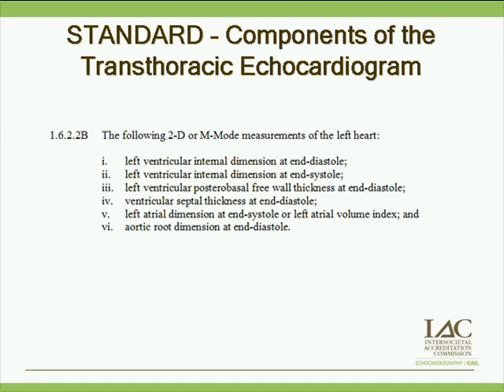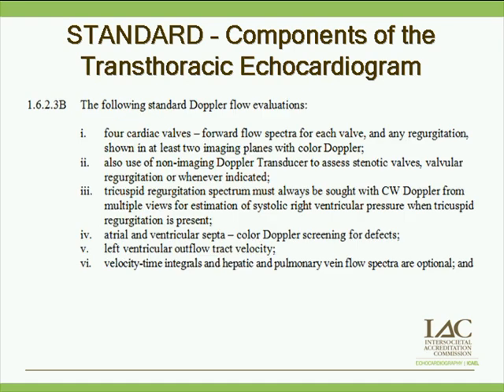The LV internal dimension in diastole, the LV internal dimension at end systole, your left ventricular posterior basal free wall thickness at end diastole, ventricular septal thickness at end diastole, your LA dimension, end systole, or your left atrial volume index, okay? So either one is acceptable, whatever your laboratory wants to do, either the measurement or the volume measurement, it's up to your laboratory. Aortic root dimension at end diastole.